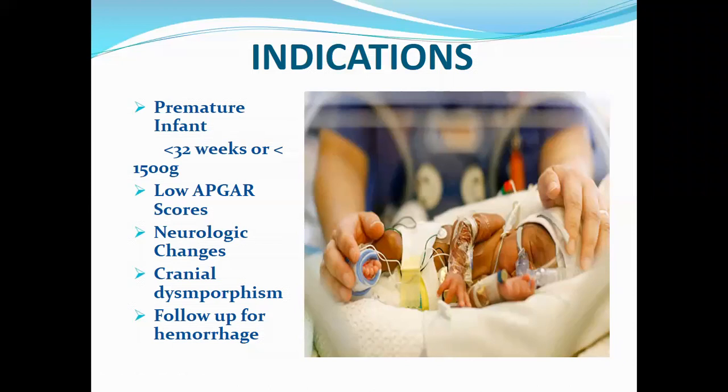Neurological changes also will warrant an intracranial scan. Cranial dysmorphisms like microcephaly will also warrant it. Dysmorphisms just refers to an abnormal part of the body. Follow-up scans, like for hemorrhages that you usually see, are also a qualification as an indication.